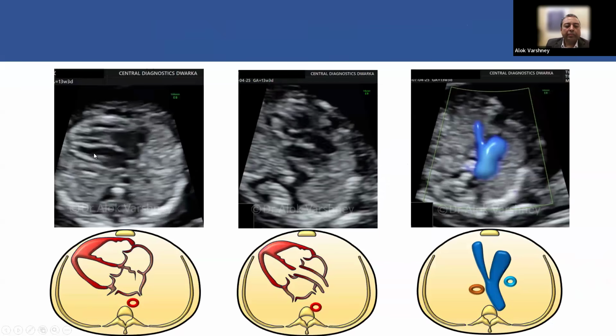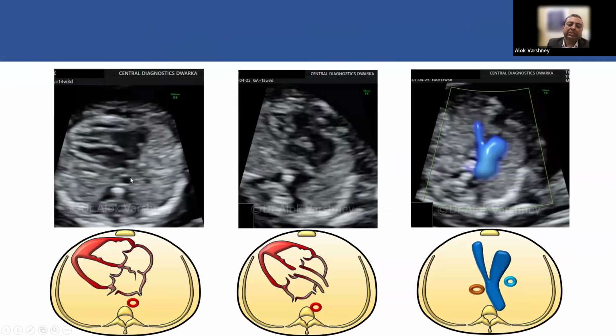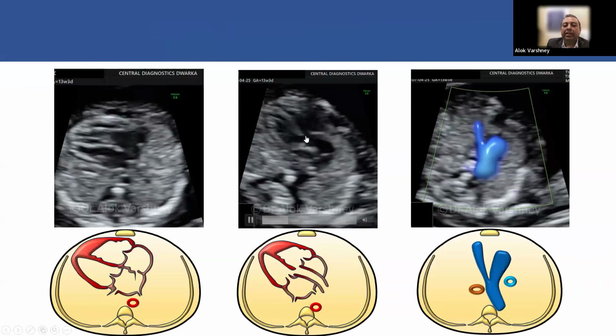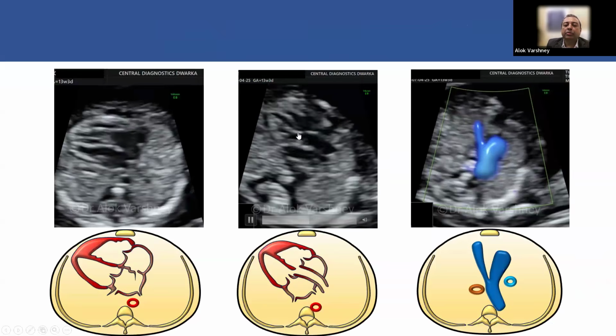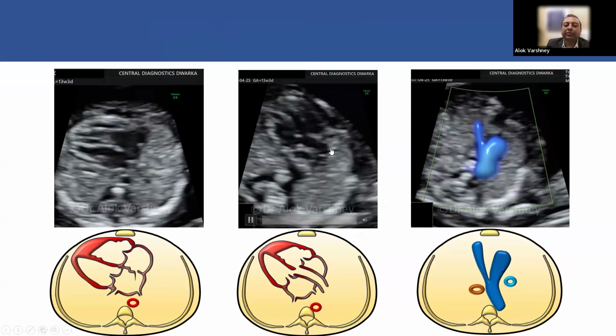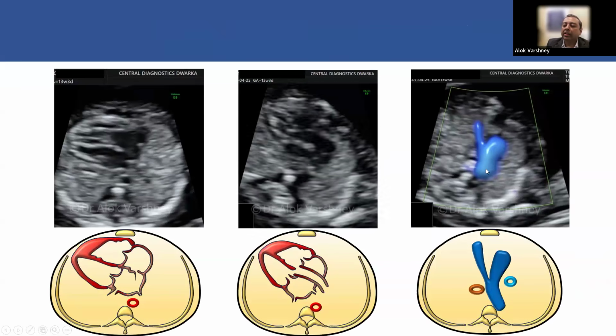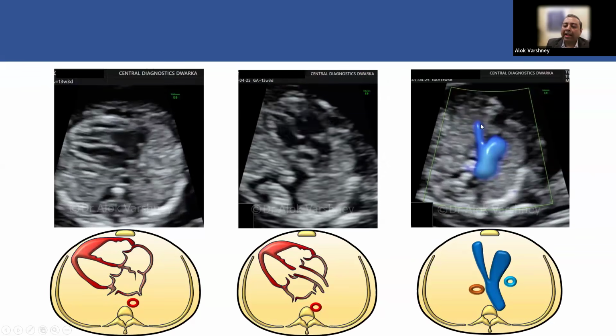So here, the cardiac axis, the heart is rotated leftward, so there's levo rotation, and that is a clue that there may be a conotruncal abnormality. And sure enough, in the 5-chamber view, we can see there's a ventricular septal defect with an overriding aorta, and the pulmonary artery is joining the aorta at an angle, appearing very narrow in caliber, but it's showing forward flow.